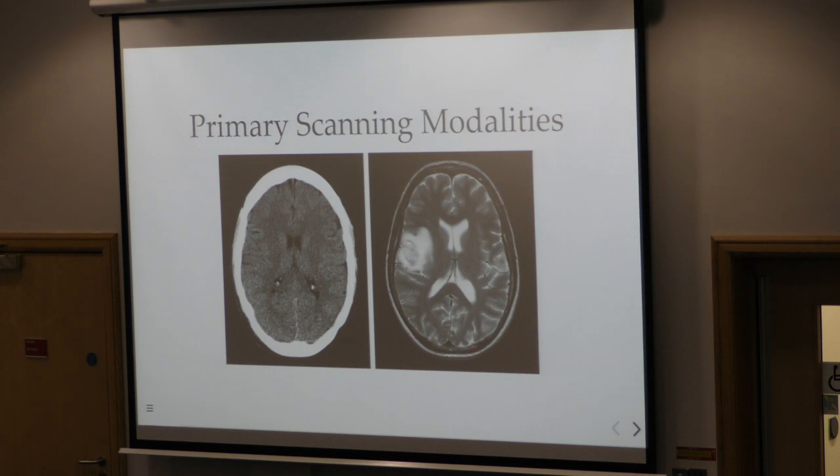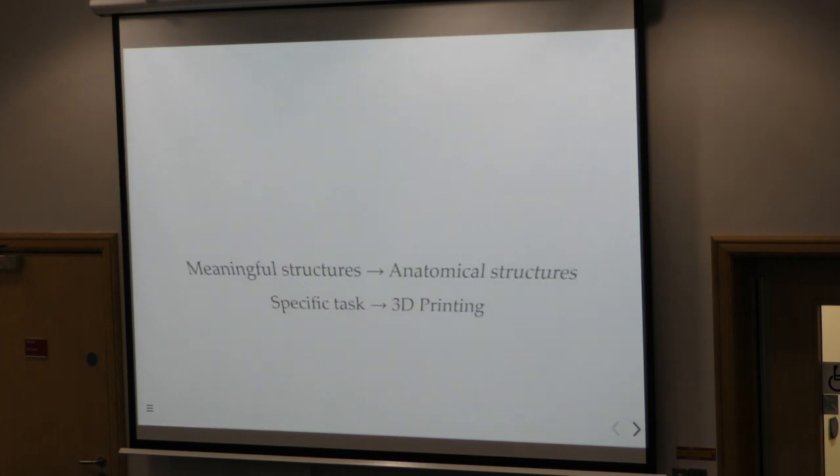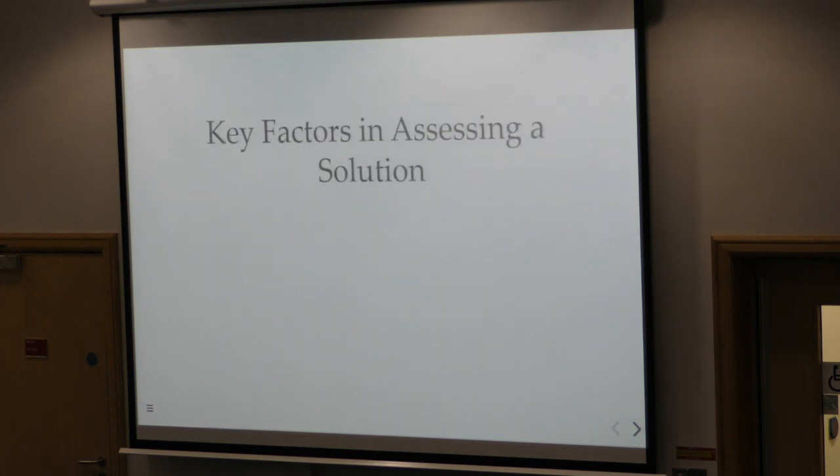Yeah. So I'll just walk you through how segmentation works. We need to define very clear boundaries between these shapes in order to act as the basis for constructing these meshes. There's a few different ways of doing this, and a few different criteria we use to assess different solutions for segmentation. So, how robust is the solution?